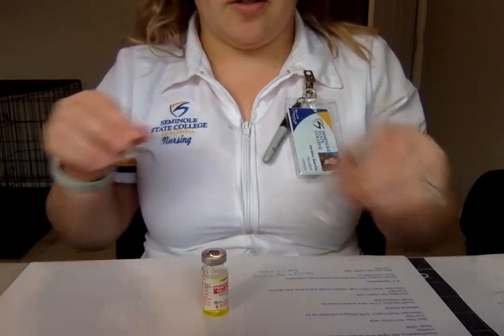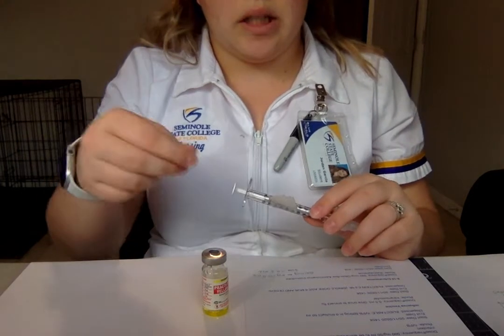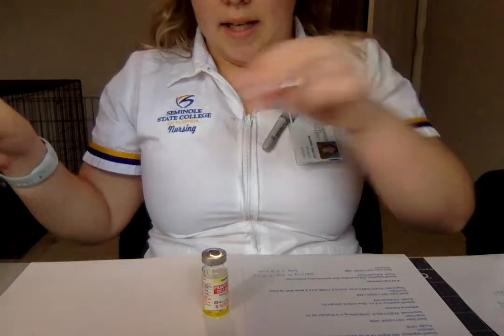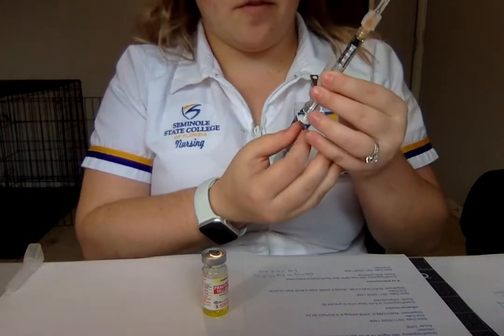And then I'm going to do the same thing, pull back 0.5 mLs of air into the plunger, and then inject it air to air, and then pull back my syringe. Again, I'm going to set this to the side so I can do the one-handed scoop. I'm going to pull back 0.5 mLs of air.